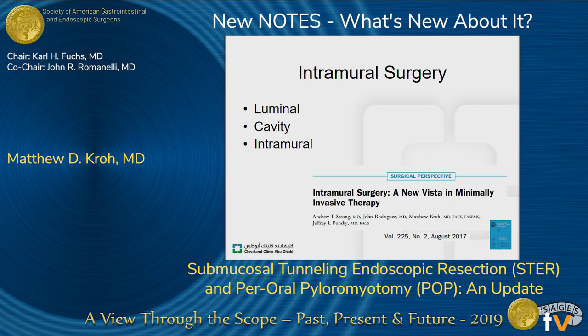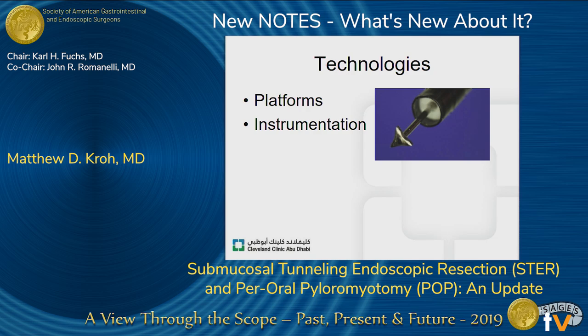So, continuing with the topic of the session, intramural surgery is neither luminal, which is standard endoscopy, or cavitary, like laparoscopy, but it's really a third space. And Silvana talked about this, and it's a new realm of access that we use an endoscope to perform surgical procedures within the wall of the GI tract. And what's allowing us to do this?